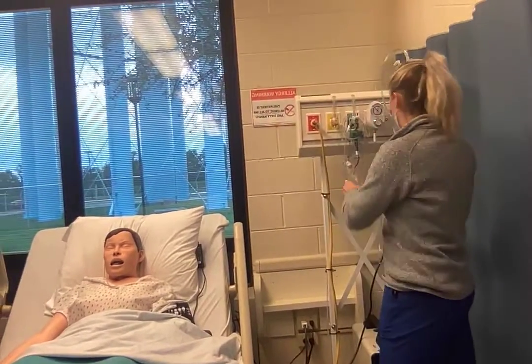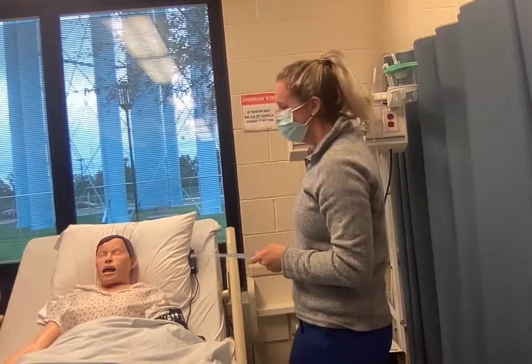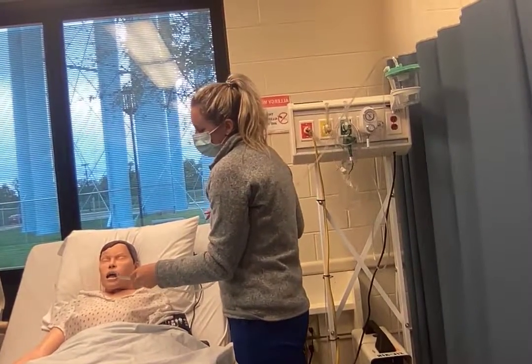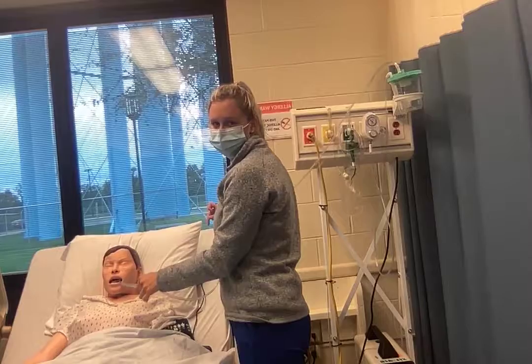After that, I'm going to set the suction and turn it up to 150. Then I'm going to suction the patient's mouth, making sure I don't suction the lips, the tongue, the palate, or the uvula, and making sure I'm not hitting their teeth because it can break them.